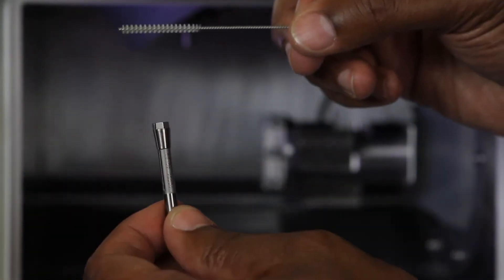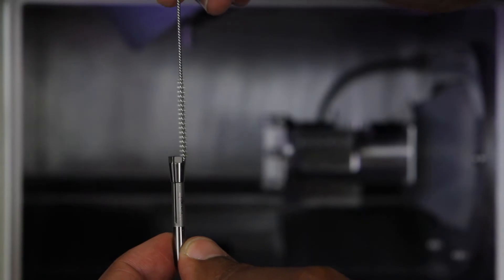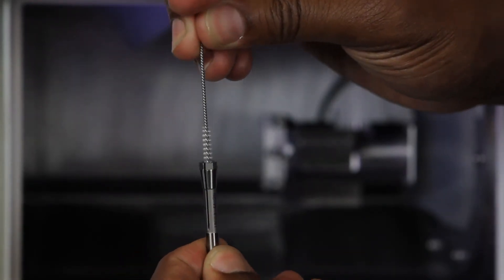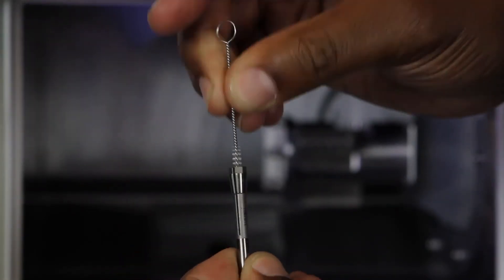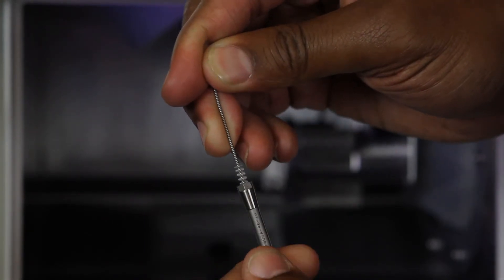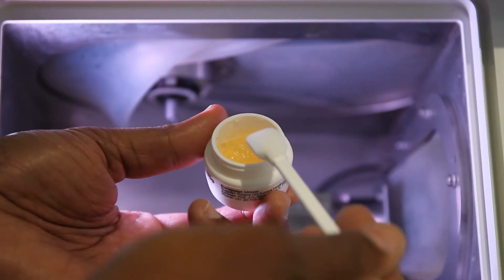Use the collet brush to clean the inside of the collet. Push the collet brush in and out and twist left and right to remove any milling waste that may be stuck inside the collet.